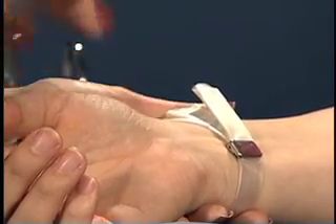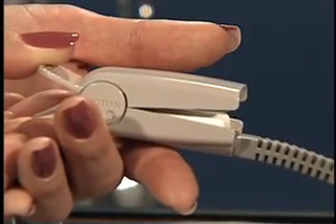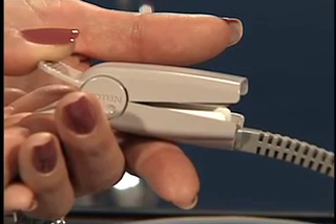Select an appropriate sensor probe for your client. Probes come in pediatric and adult sizes. If the client has an adhesive allergy, a finger clip may be used as shown here.